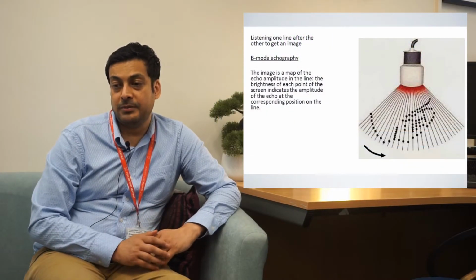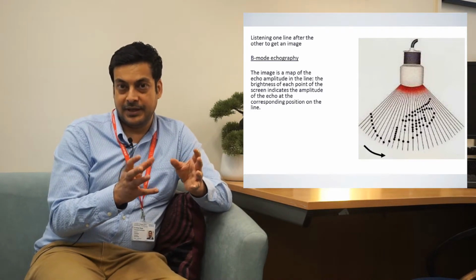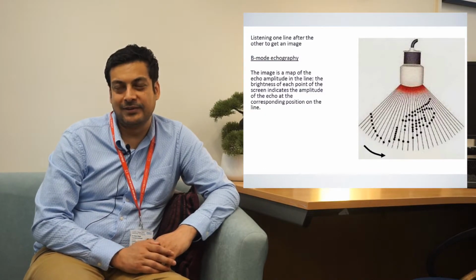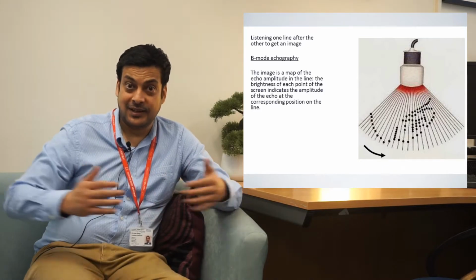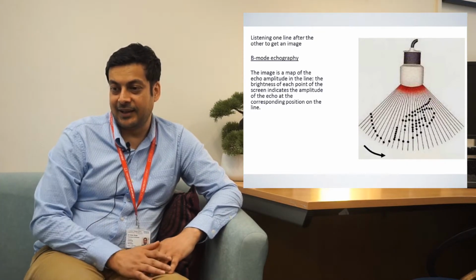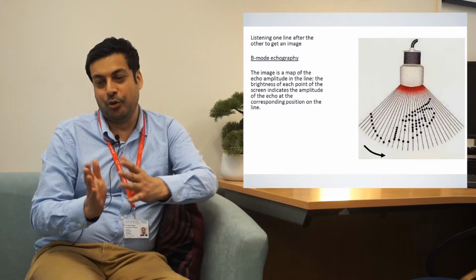In real life, the probes now have several of those piezoelectric materials in a row, so it can put out multiple lines of sound waves at one time, and therefore generate a 2D, even 3D picture in a grid-like pattern of crystals, straight away in one go. And so you're seeing that here. You're getting the multiple sound waves reflecting against a structure, and therefore you start to see things like, say, the wall of the ventricle.